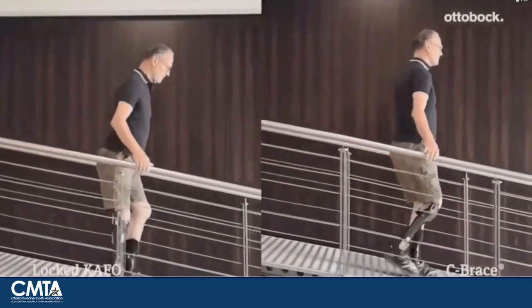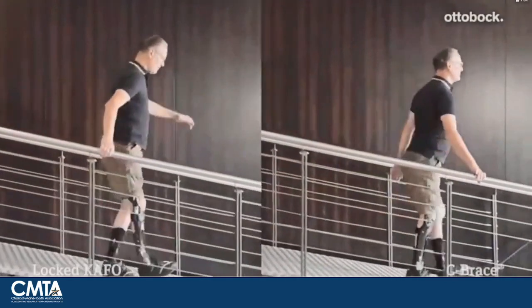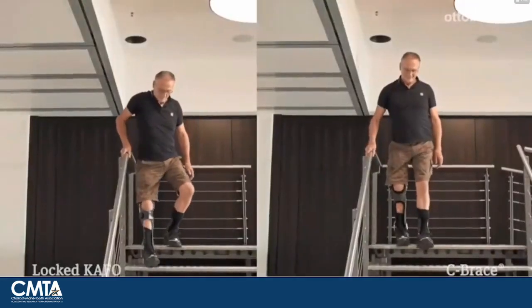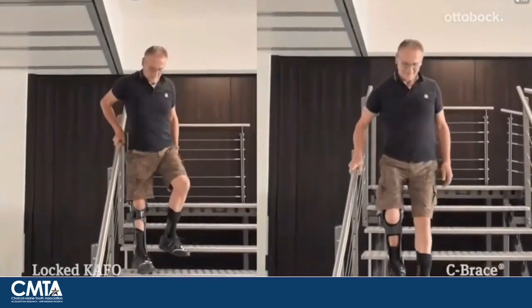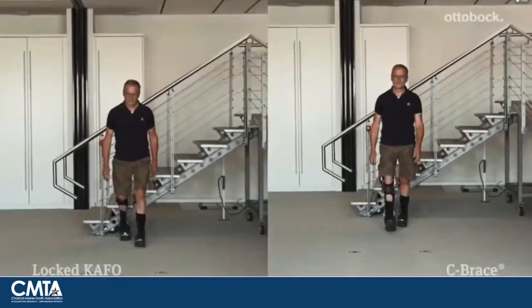Whereas when he's wearing the C-brace, he's able to just guide his hand down that bar just in case he happens to need it, not really relying on that upper arm or that upper extremity to help him down that ramp. Same thing in the locked KFO on the left there, you can see his shorts bounce every time he hits that next step. Whereas with the C-brace, it's in a much more controlled manner.